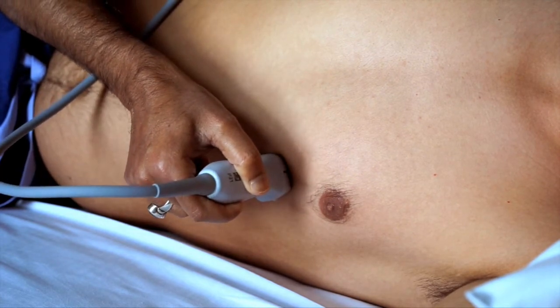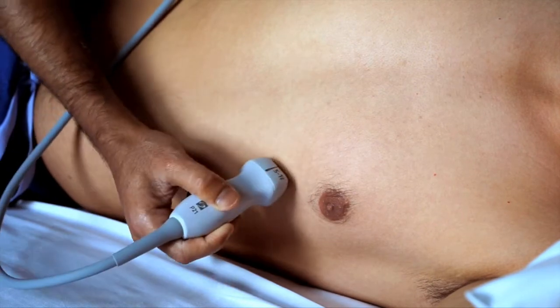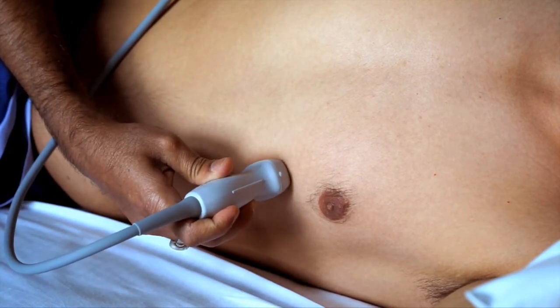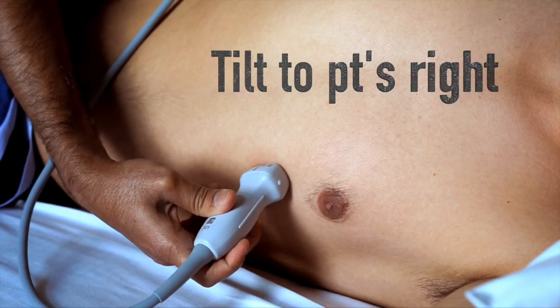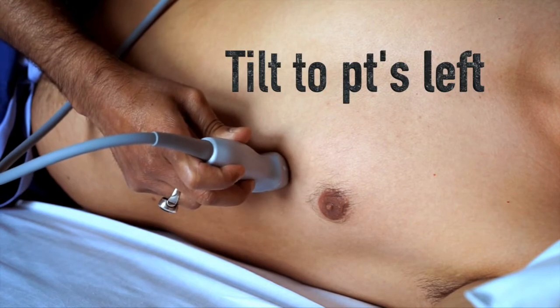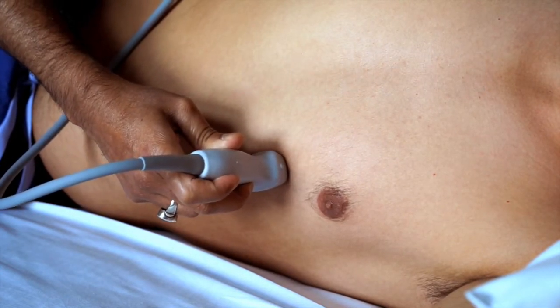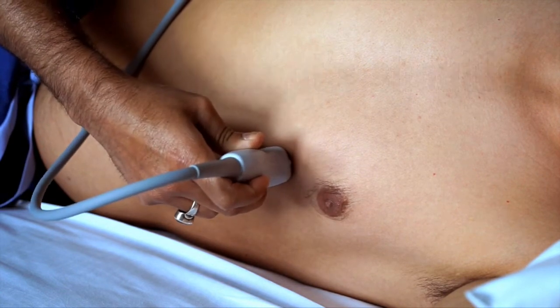The next is the tilting of the probe. Now the tilting of the probe is in relation to the probe moving sideways, either to the patient's right side or left side, or in relation to a particular body part, like tilting towards the patient's shoulder.